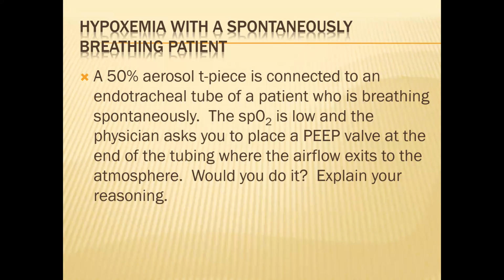It's the absolute worst idea to take somebody off the ventilator and put them on an aerosol T-piece. It's hard to breathe through that endotracheal tube. Why not have a little pressure support from the ventilator? Why would you want to DC the ventilator to just put them on an aerosol T-piece? I feel like there were other options. Other options for what? They could have done anything. Yeah, true. Okay. Yeah, high flow would have been a possibility.